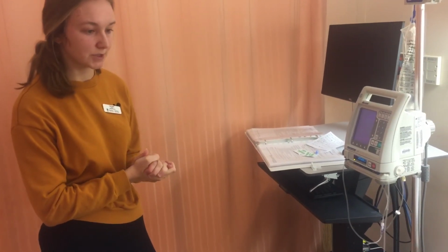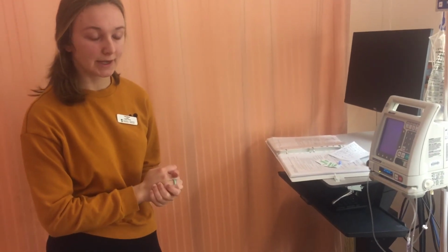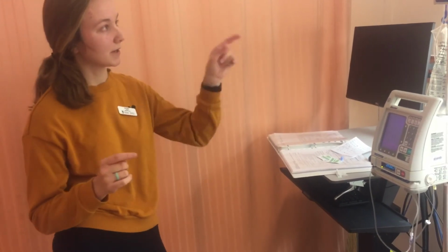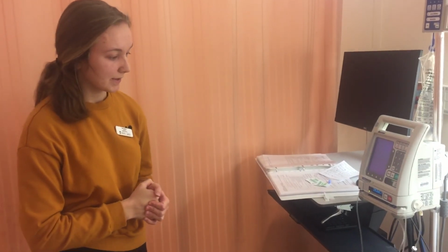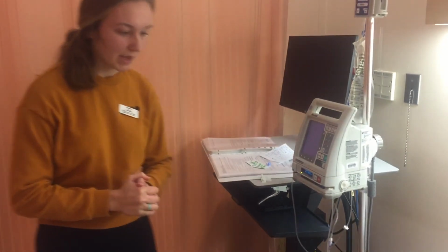If you have any issues, just let me know. And I'm just going to be also monitoring the white blood cell count because we want to make sure that the medication is therapeutic. So in half an hour, I'm going to come check to make sure that the primary line has begun infusing again, and then I would do my exit safety check, make sure the bed's in the lowest position, the call bell's within reach, and all of the clamps on the tubing are undone, and then I would exit the room.